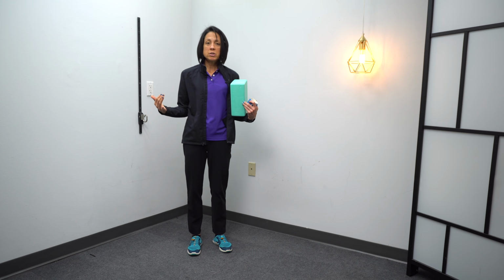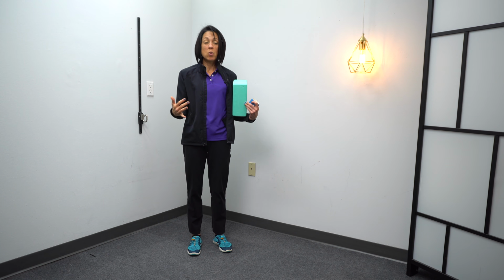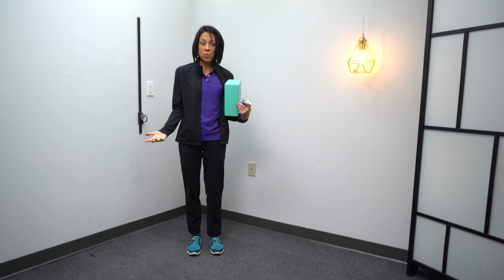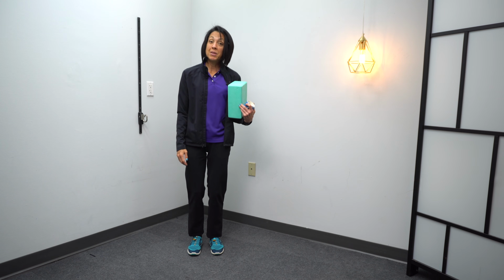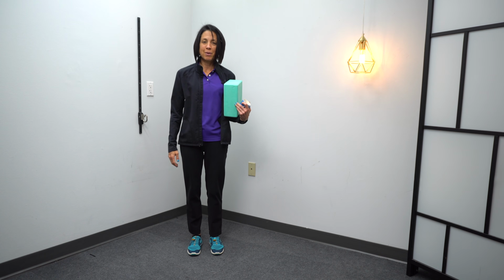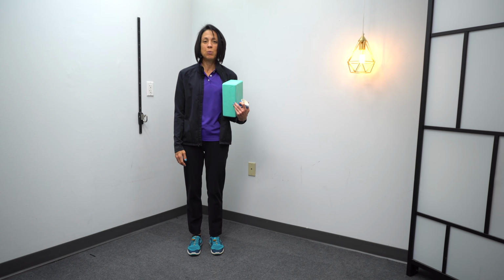So what is normal, or based on what we know about the potential abnormal movements, what are some potential ways that we want to normalize movement, and what does that normal movement look like? With that list of abnormal in mind, one thing that we want to do is try and find ways to keep the knees in when you load the leg. You guys have heard me talk about this a lot before, but now we're going to go over the actual tools that help with that.